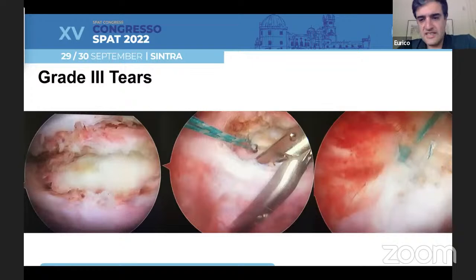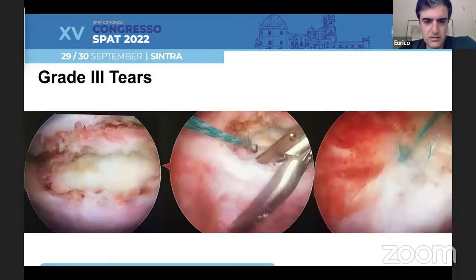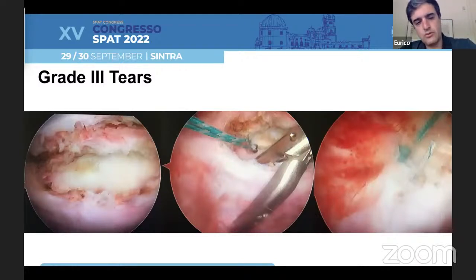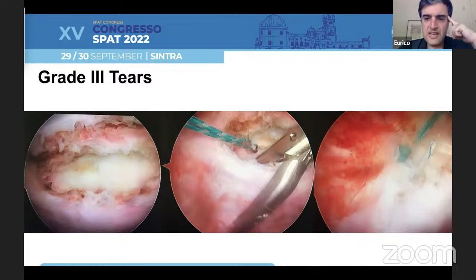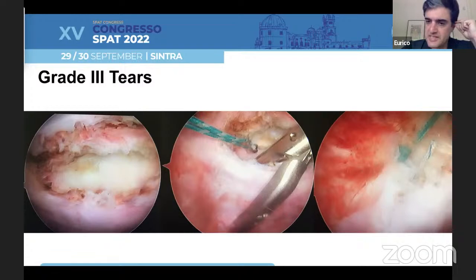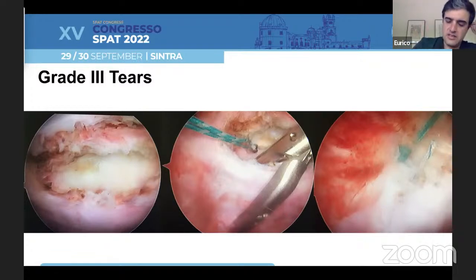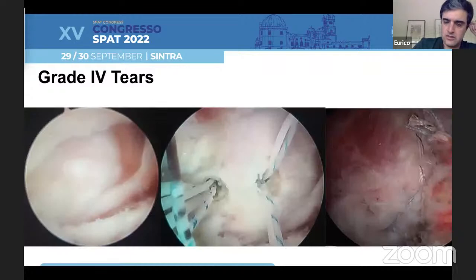Here is an example where I put two anchors — you can see them being placed on the bald spot, the bald spot is exposed — then we have the anteromedial and anterolateral leaflets of the tendon. We use suture passers, exactly like the ones we use in the shoulder, and we close down this tear side by side using the two anchors placed on the bald spot.